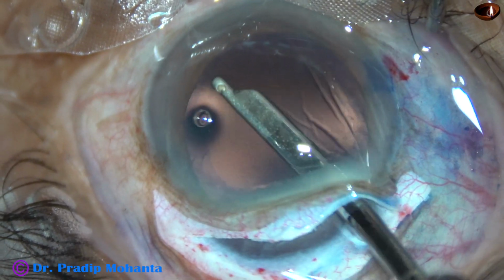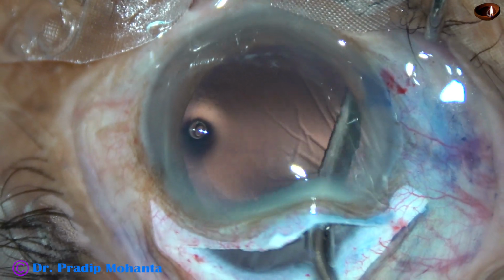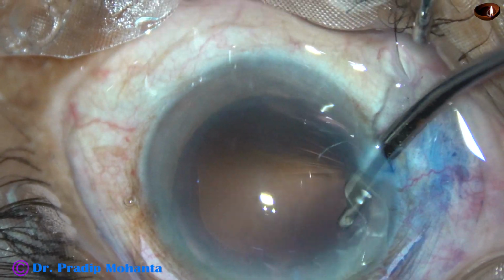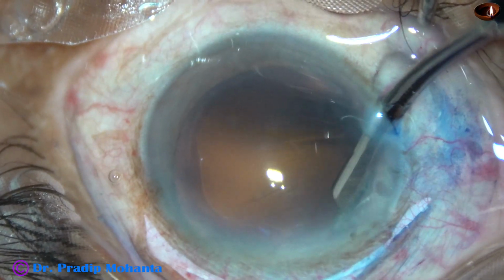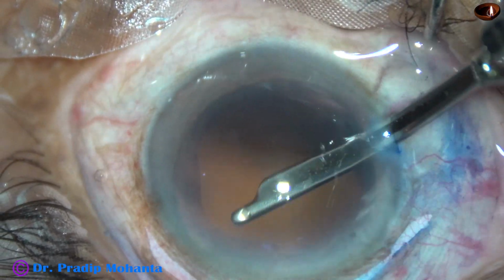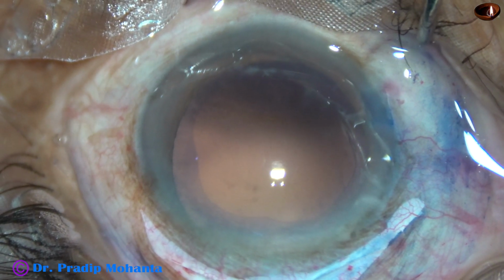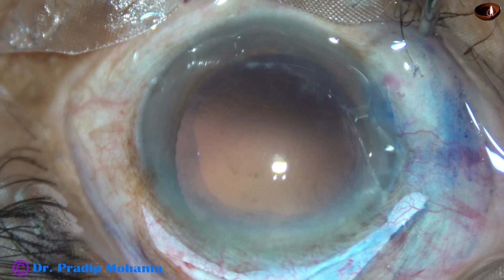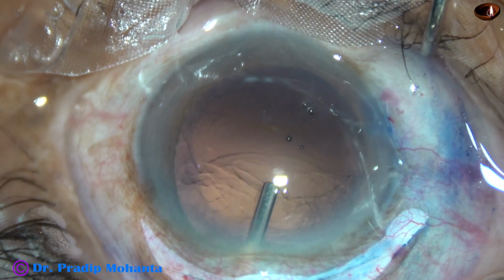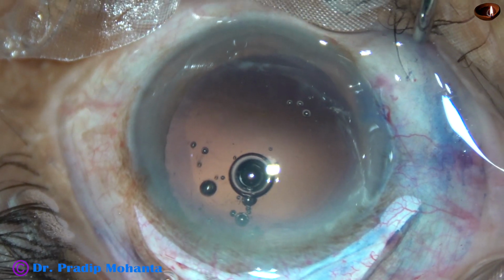Though I am going through the main incision, the anterior chamber is formed. It is not shallow because I am lifting the anterior wall of the main wound. Now I go through the side port and remove the subincisional cortex. See how safe this surgery is for the corneal endothelium and for the posterior capsule. And the large wound is going to heal very nicely within a month or so.